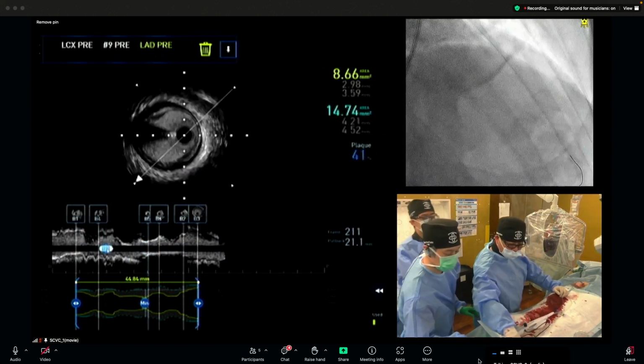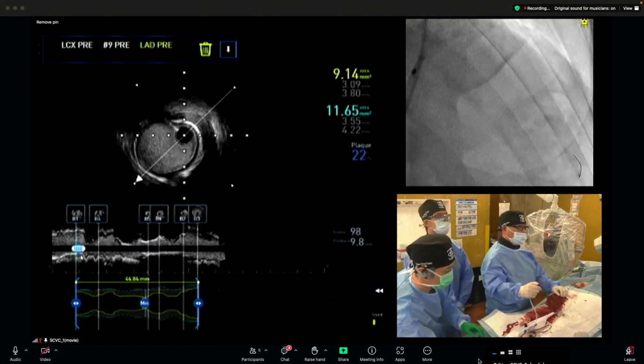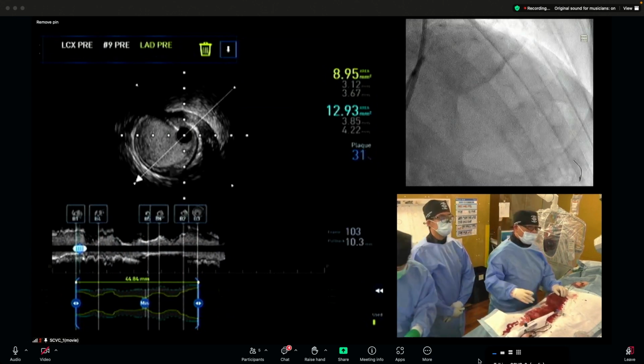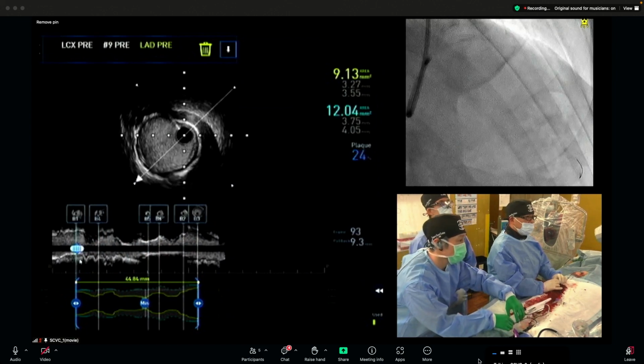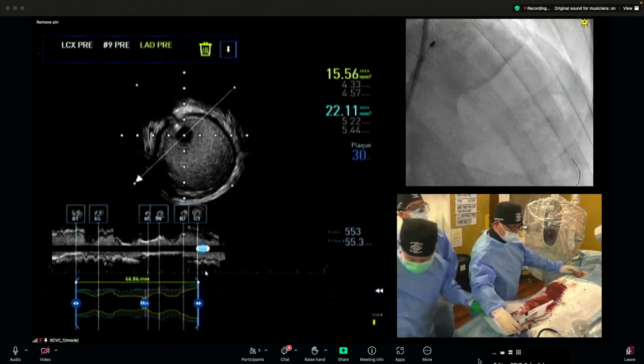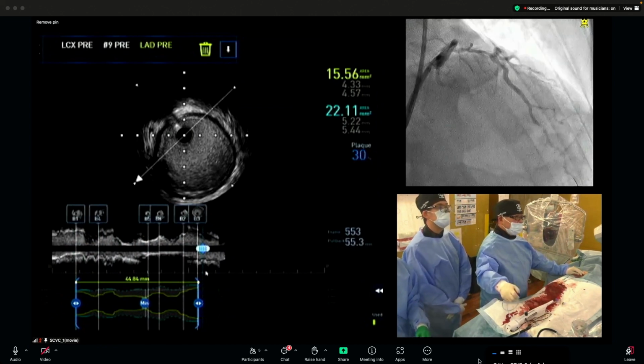And the last part is the discrepancy in vessel diameters at the proximal and distal reference sites. The vessel diameter distal is 3.5, but left main is 5.0. So this is a key point of this IVUS finding.